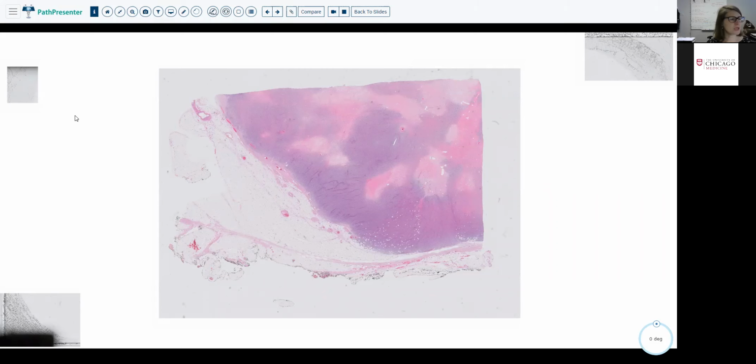So if you all liked the control screen, drive it yourself and describe what you see, we could do that. If anybody wants to try it, let me know. This is the first case. It's obviously a resection. Any brave volunteers?